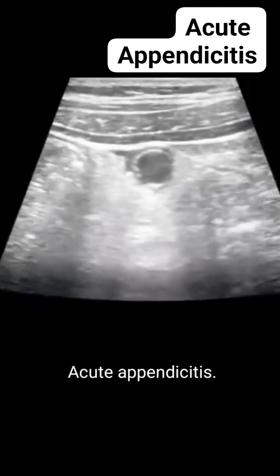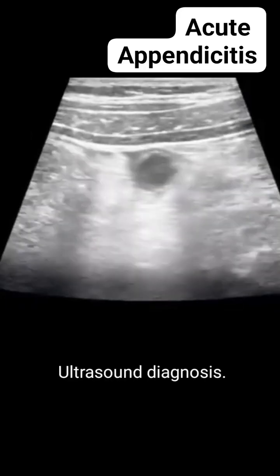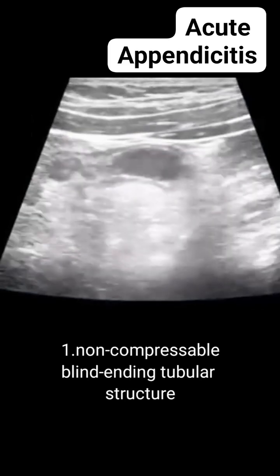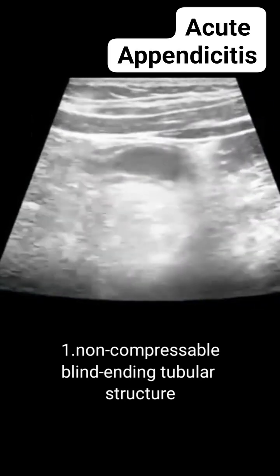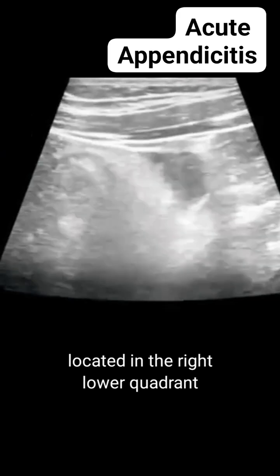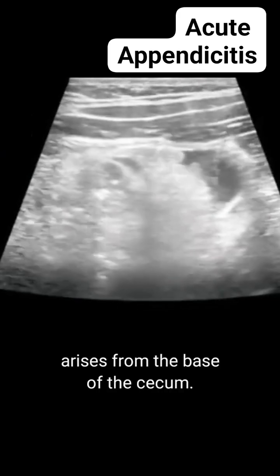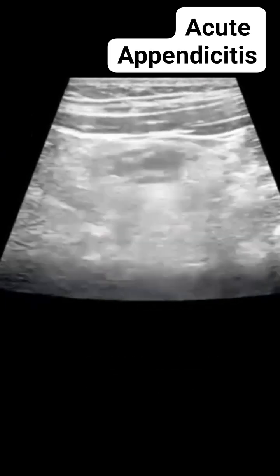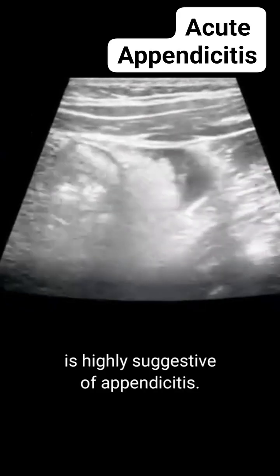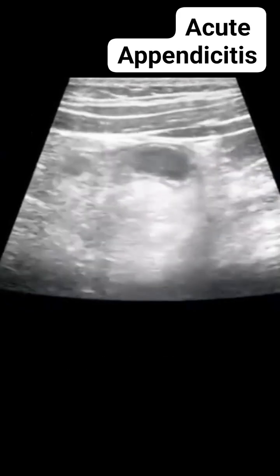Acute appendicitis: Ultrasound diagnosis. Criterion 1: A non-compressible, blind-ending tubular structure located in the right lower quadrant, arising from the base of the cecum, with a diameter greater than 6 mm, is highly suggestive of appendicitis.